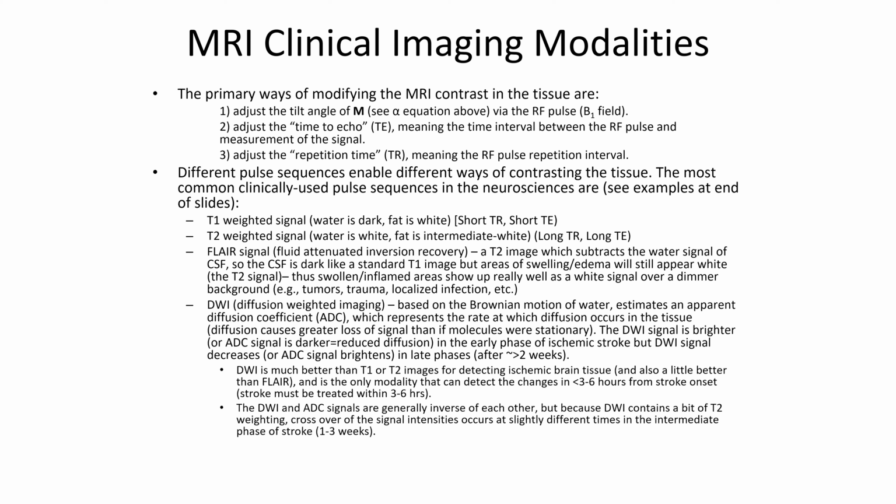The problem with CT scan is that the most common CT scan you see with an acute stroke is a normal CT scan. A stroke isn't going to show up early on in a CT scan. So a stroke is a clinical diagnosis. It's not a radiologic diagnosis. But DWI really narrows down what we can do. We can get a better sense of whether the brain is ischemic early on, hopefully within that 3 to 6 hour window where you can actually do something like fibrinolytic therapy or anticoagulation therapy.